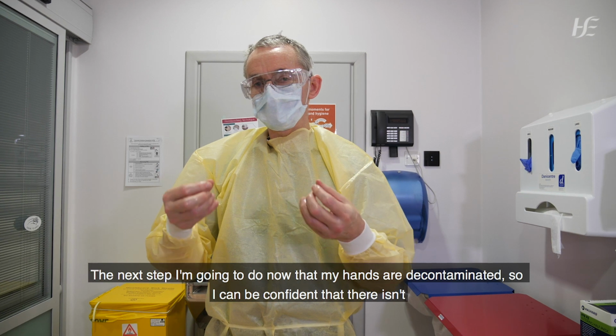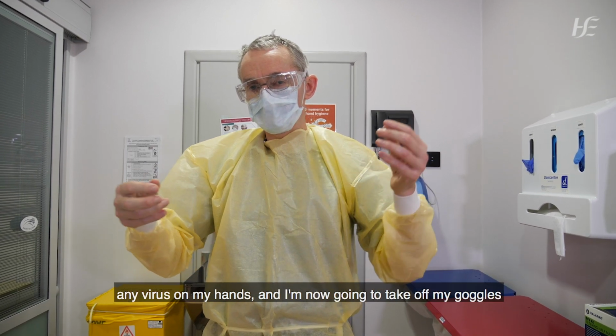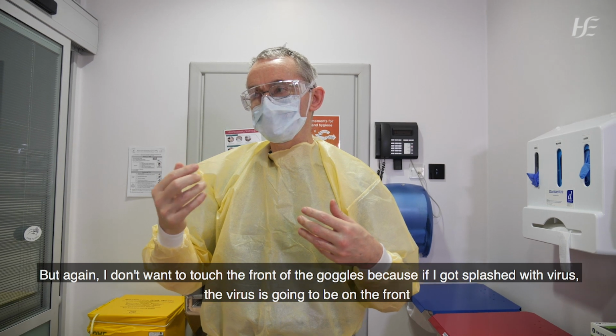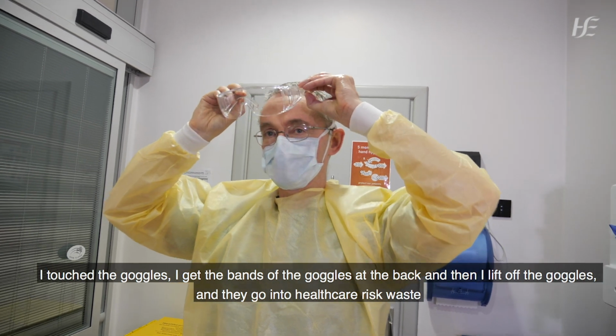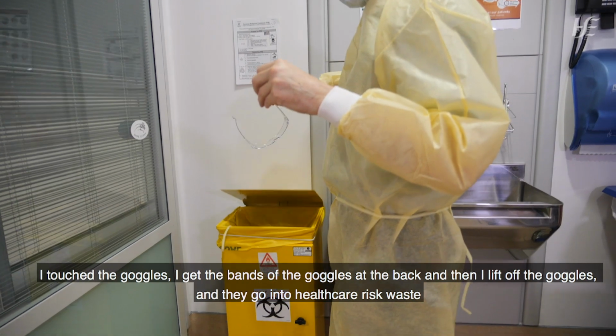So the next step: my hands are decontaminated, so I can be confident that there isn't any virus on my hands, and I'm now going to take off my goggles. But again, I don't want to touch the front of the goggles because if I got splashed with virus, the virus is going to be on the front. So I get the bands of the goggles at the back, and then I lift off the goggles, and they go into healthcare risk waste.